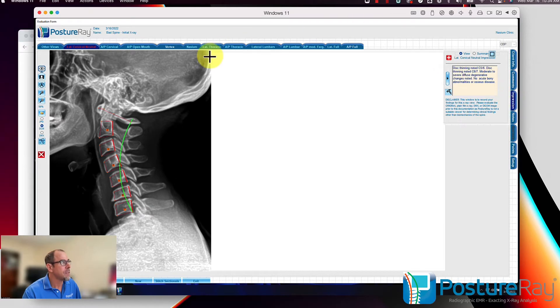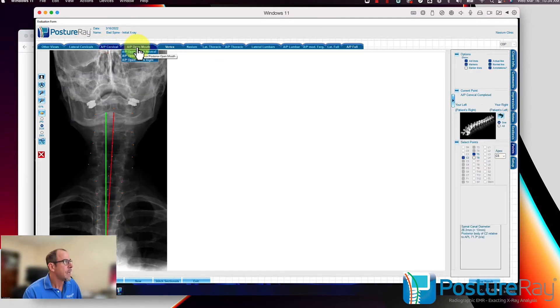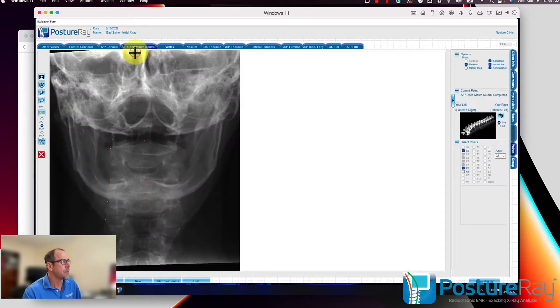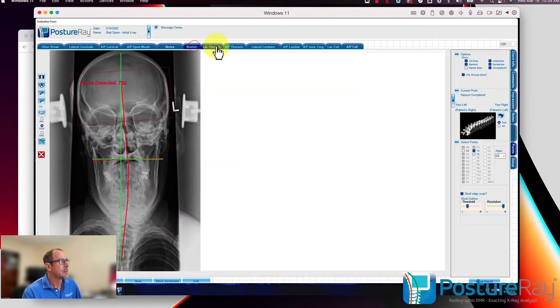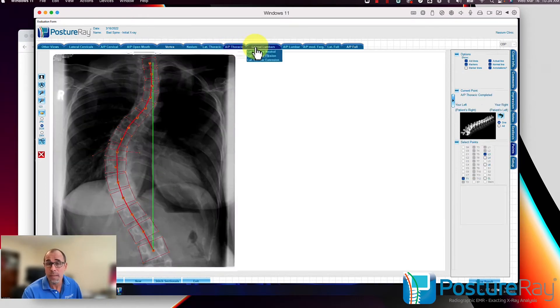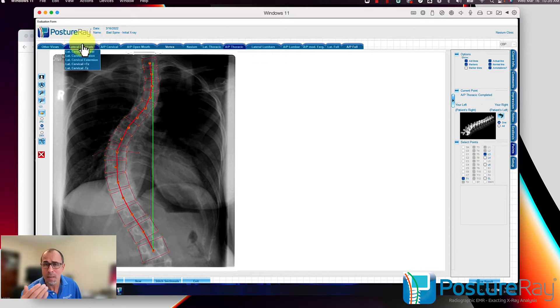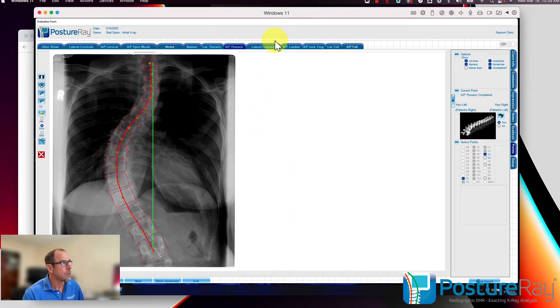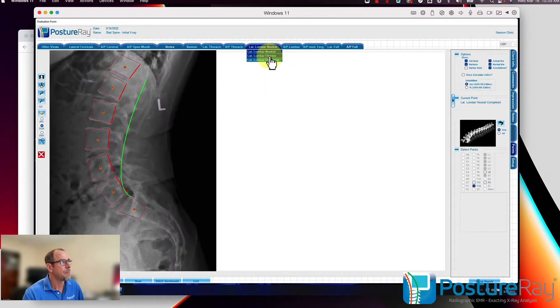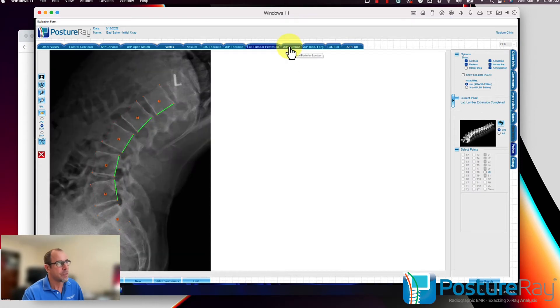We have other X-rays already done. I already have the flexion extension done. We have AP cervical, AP open mouth, nasium, lateral thoracic, AP thoracic with scoliosis — we can even do Cobb and Reiser-Ferguson methods of analysis. For lateral cervical instability, we do the AMA guides fifth and sixth edition, as well as the posterior tangent method, which is the superior method for instability analysis, plus pennings assessment. With scoliosis, we also measure rib angles, and we do flexion extension with the lateral lumbar and AP lumbar with scoliosis as well.